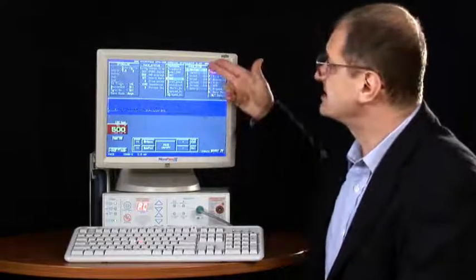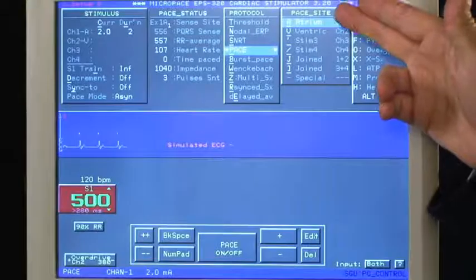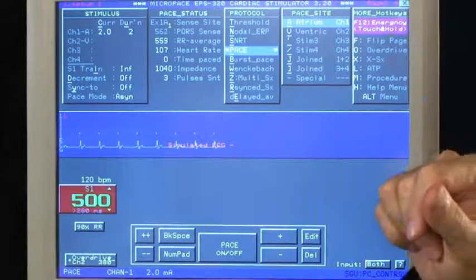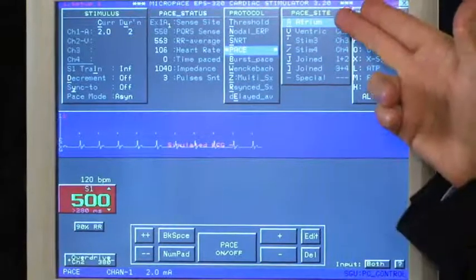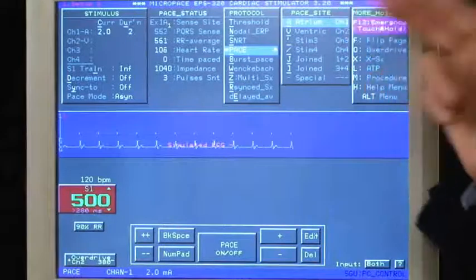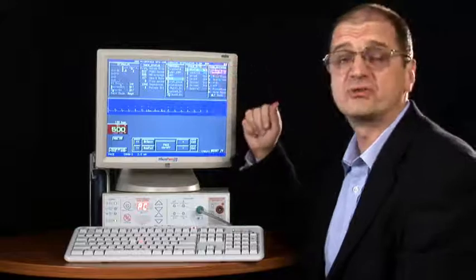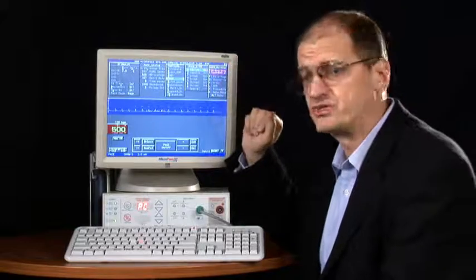Pacing side controls which channel, channels 1 to 4. By convention, we prefer channel 1 to be in the atrium and channel 2 in the ventricle.